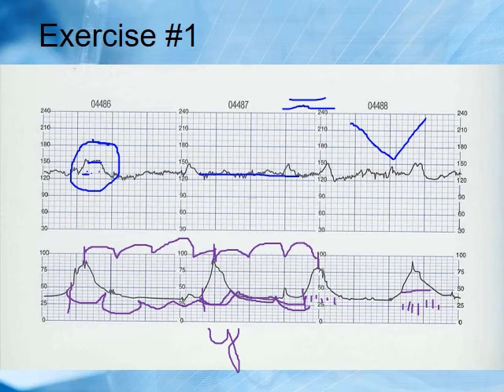So our report to the physician would be, she's contracting every 3 minutes, lasting about a minute long, and the heart rate baseline is 130 with moderate variability, and she's having some accelerations. I'm thinking she might benefit from Pitocin because we could get those contractions closer together, but baby looks good. Okay.